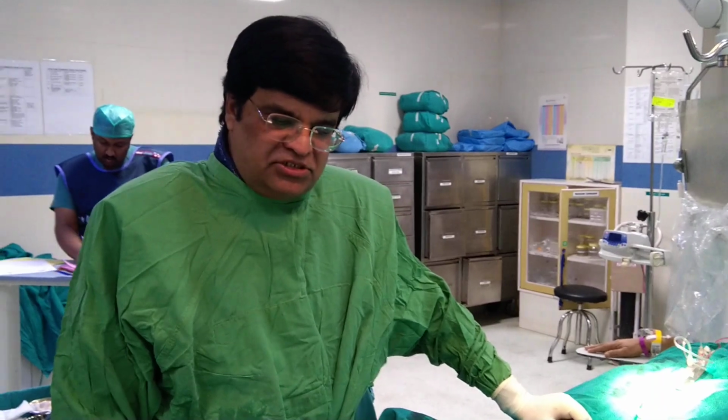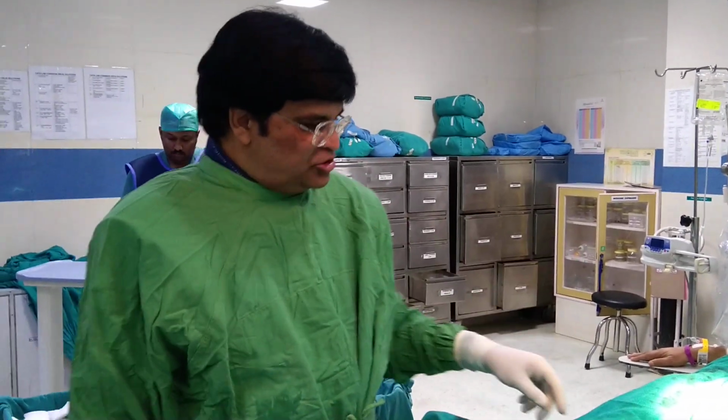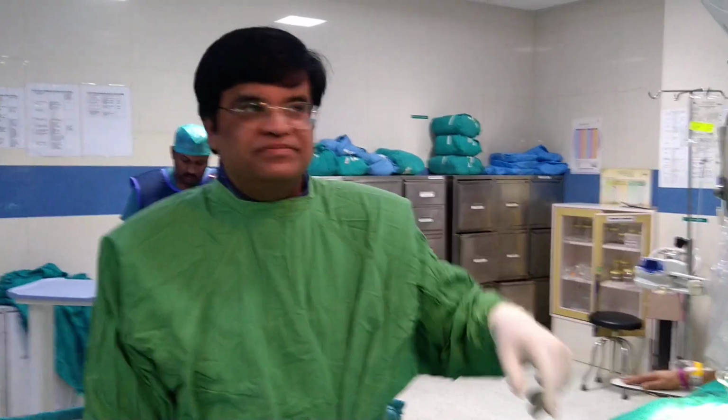A case of recent acute coronary syndrome, with almost double vessel disease with an additional diagonal, but the LAD was non-critical. We have done angioplasty, just giving a few points which are interesting. I'll show you the angiographic picture.